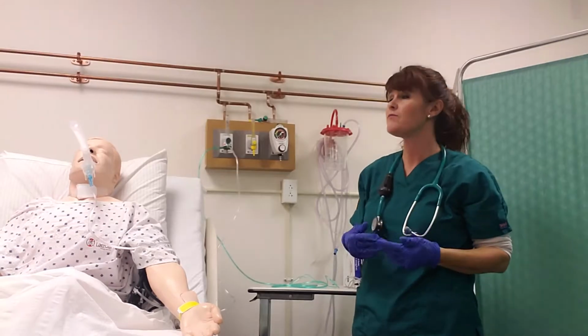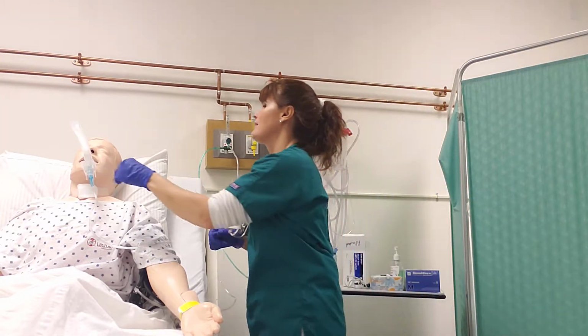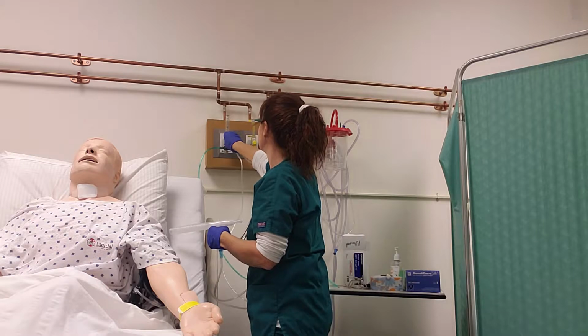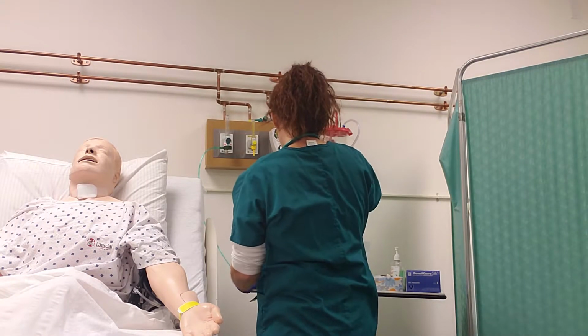All right, so we're gonna fast forward and pretend the treatment's over. We heard it sputtering. All right, thank you, Mr. Wilson. You did a great job. Okay, so the doctors wanted you to have a little bit of oxygen.